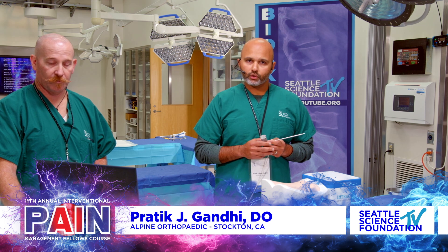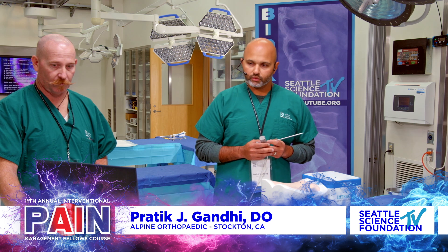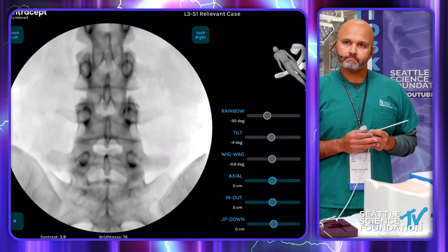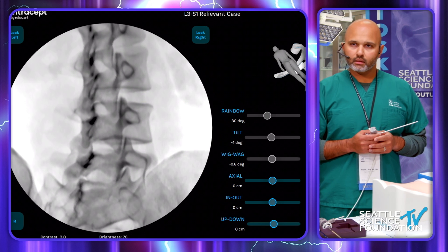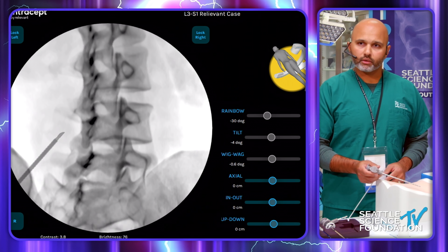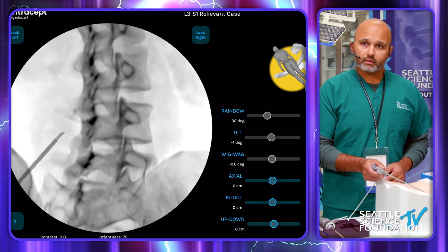The next thing you want to do is oblique over to the side we're doing. We'll access the right pedicle just for this purpose. We'll oblique over to the right and really get a good pedicle view where the facet is right about 50% of the superior end plate. We'll essentially mark right down the eye of that pedicle at L4.